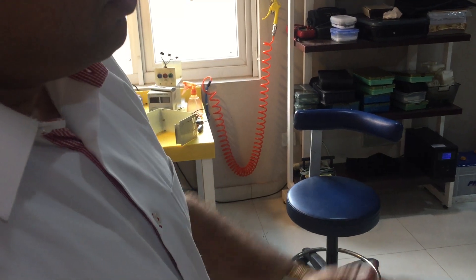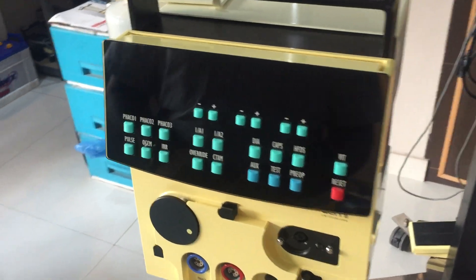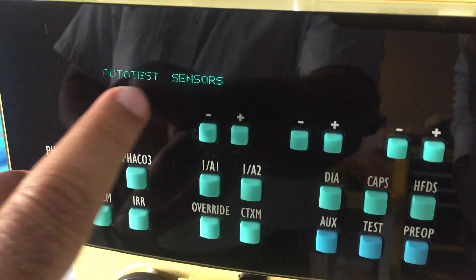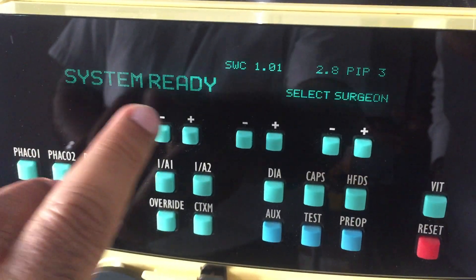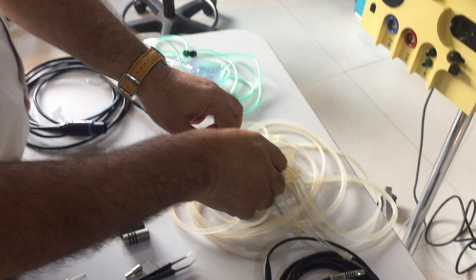This is a Cutter X3 system. Switch on the machine from the back side using the button. You will see the message 'auto test' and then the system is ready. First of all, you have to connect the tubing with the machine.